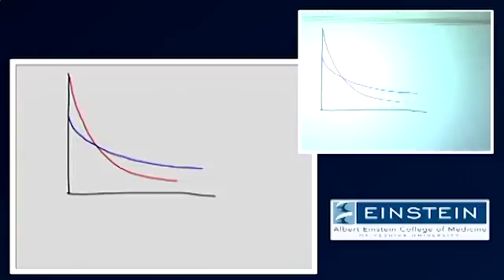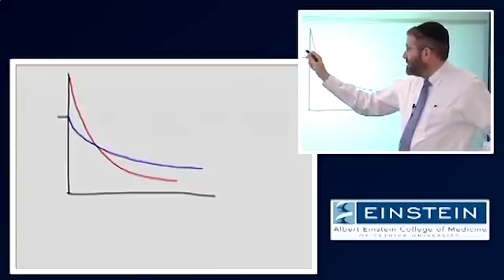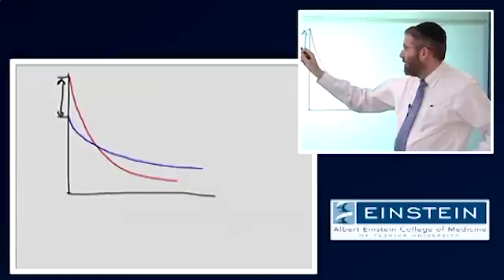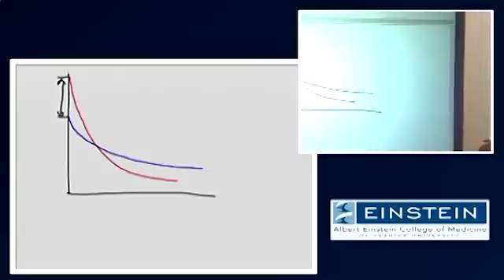Okay, so this is the example we just looked at, where the TR was relatively short. This difference is going to be determined by that TR, by T1 relaxation.